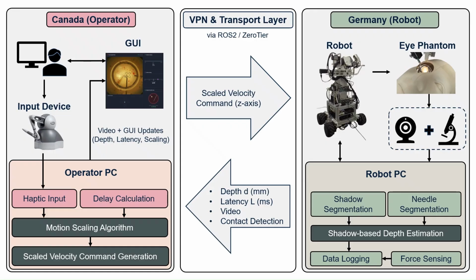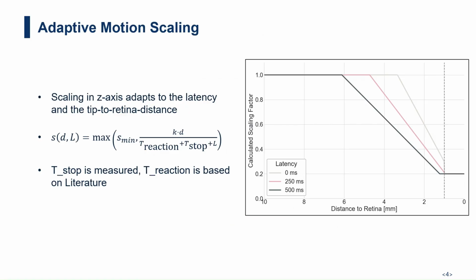All of these things are connected to the robot PC, where we're using shadow-based depth estimation, data logging, and a force sensor is attached to the robot. All of this data is sent back to Canada, where the surgeon can see the most important information on a GUI.